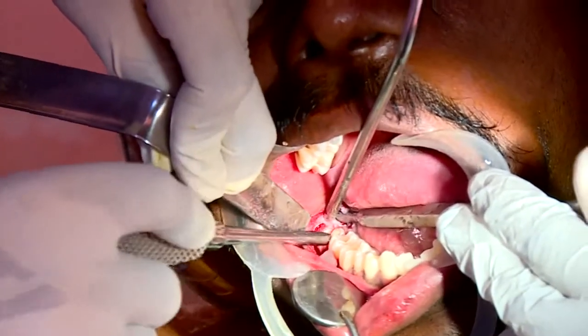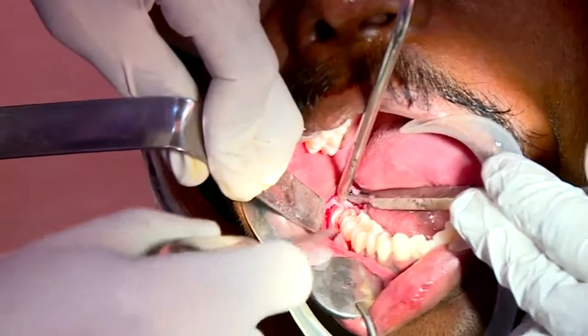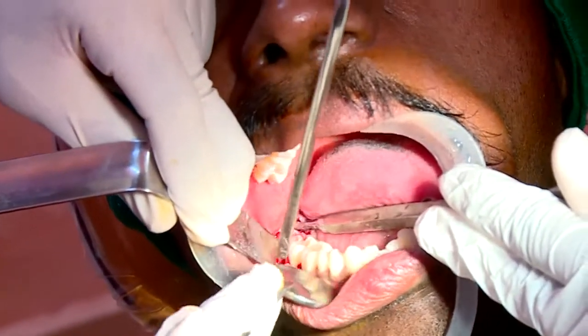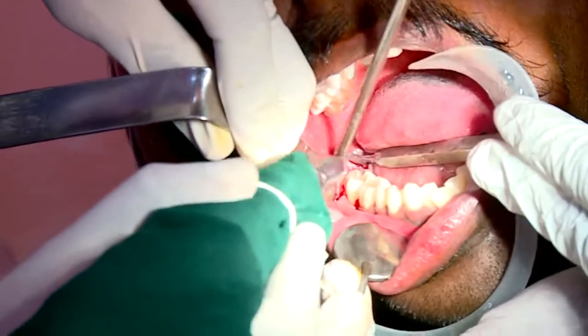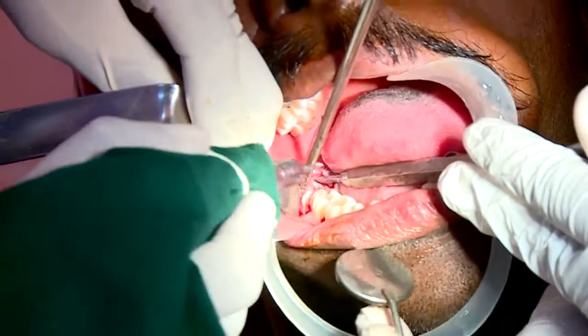Usually we split the tooth because of what is called a tooth lock. Okay? Most of these horizontal teeth, the crown is locked by the crown of the second molar tooth. That's why that mesial crown is highly wedged below the cusp of the 7.